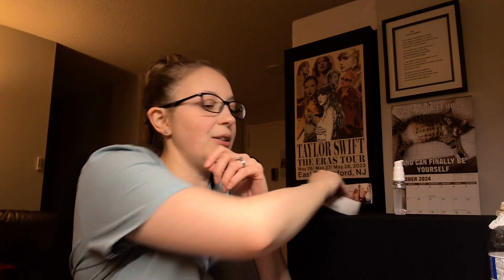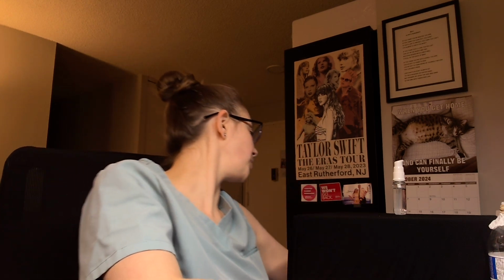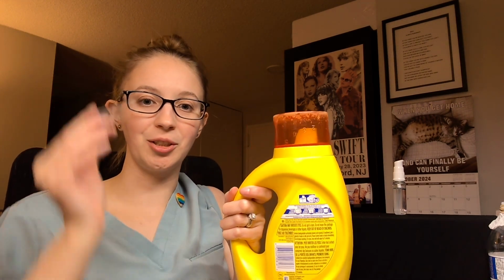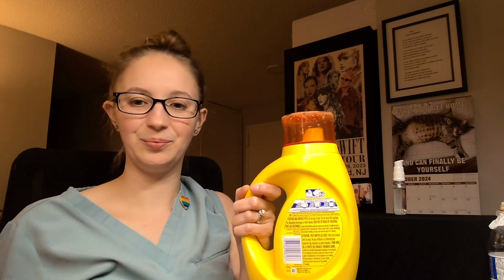Okay, so last steps. You go ahead and get yourself a Band-Aid. Slap that on. And then you make sure all of your needles are off, like this. And you grab your sharps box. Or in my case, a sturdy plastic laundry detergent works just fine. And you can go ahead and put them in there to dispose safely of your sharps. Now give yourself a high five. You just affirmed your damn self.